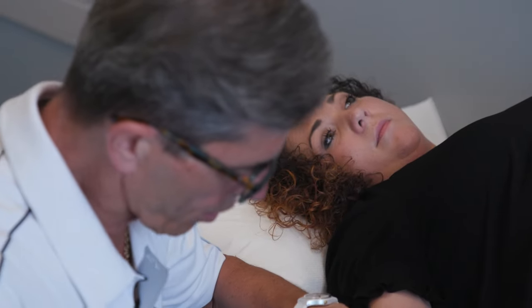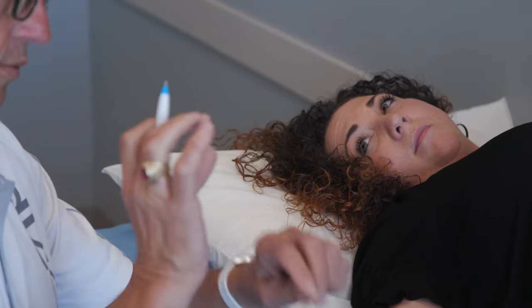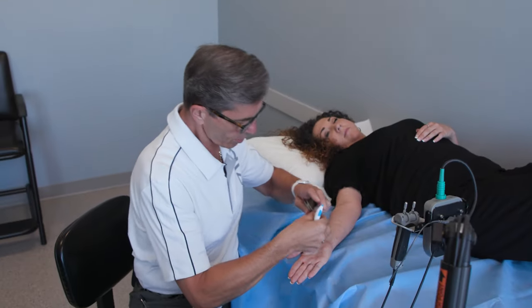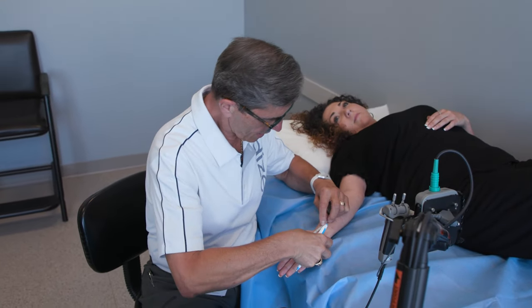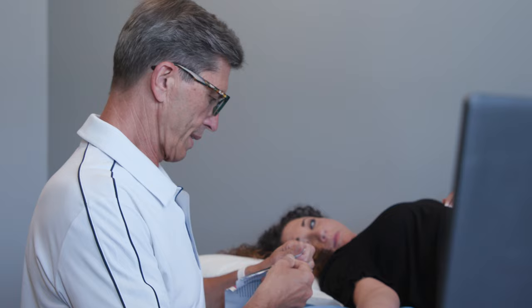When we start, we're going to start with a zero shock — we don't give you any electricity at all, just a zero point starting point. We turn it up a little bit at a time just to make sure that you can tolerate it. If you have any questions along the way, just let me know. These will record the results of what we're doing.